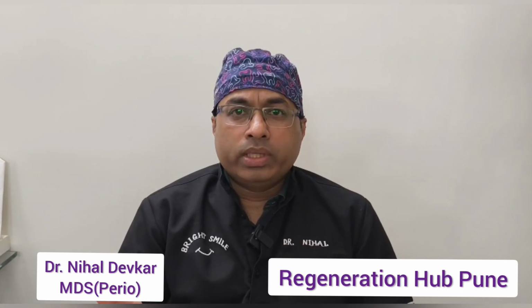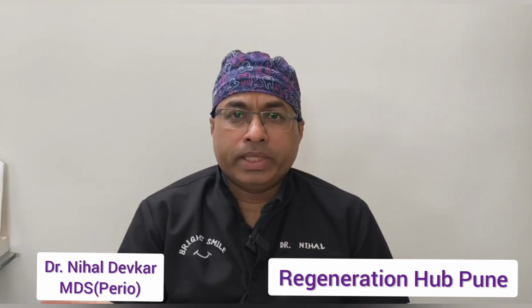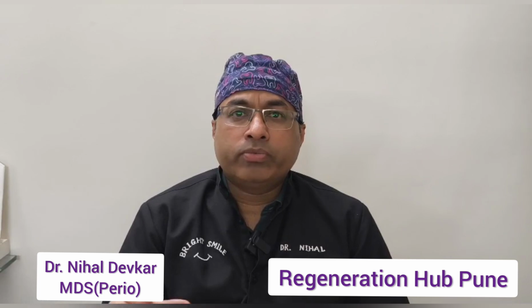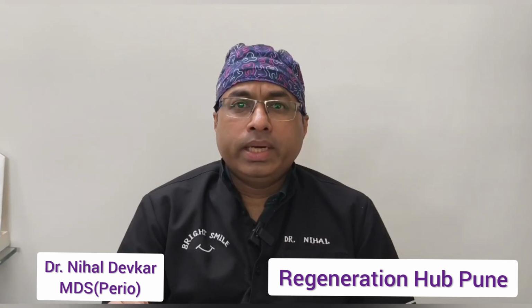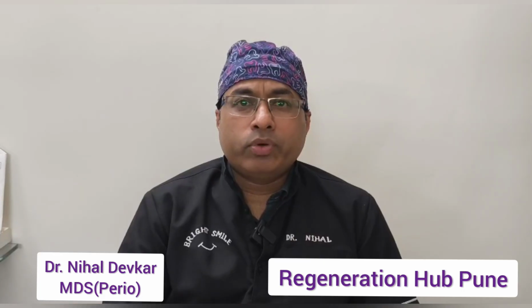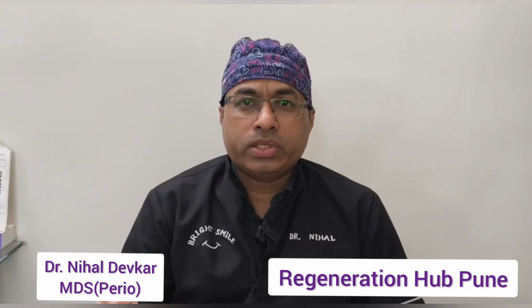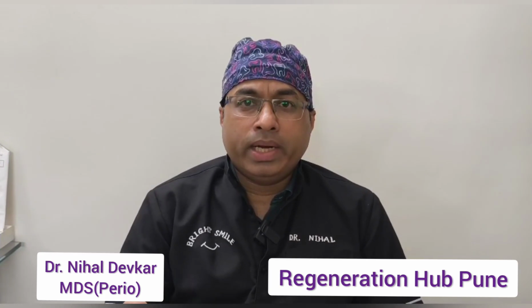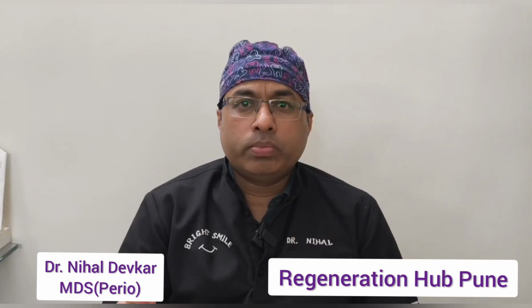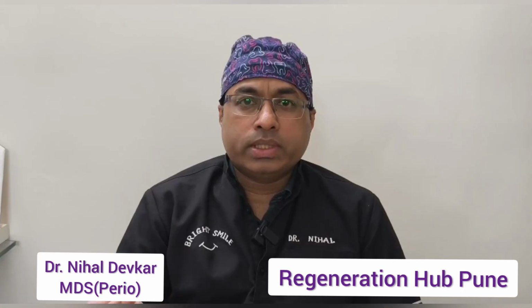In spite of doing all this, if there is not enough adequate crown structure to give a crown or a bridge, then we have the option of performing the crown lengthening procedure. The major indication, or the requirement, for this is that the site should have an adequate amount of keratinized tissue or keratinized gingiva. Once keratinized tissue is established to be adequate using a graduated probe, then we can go ahead with performing the crown lengthening procedure.